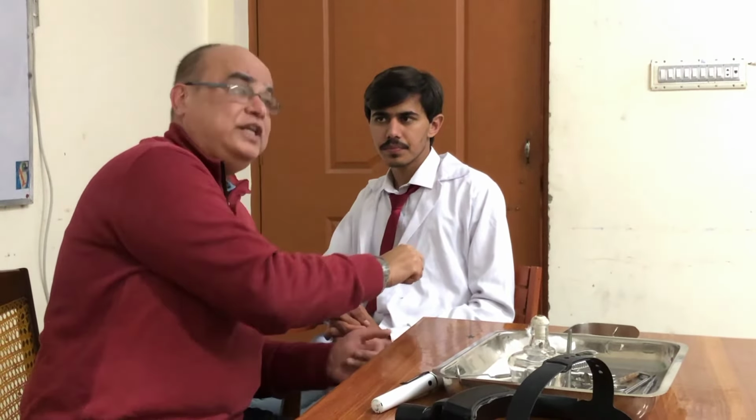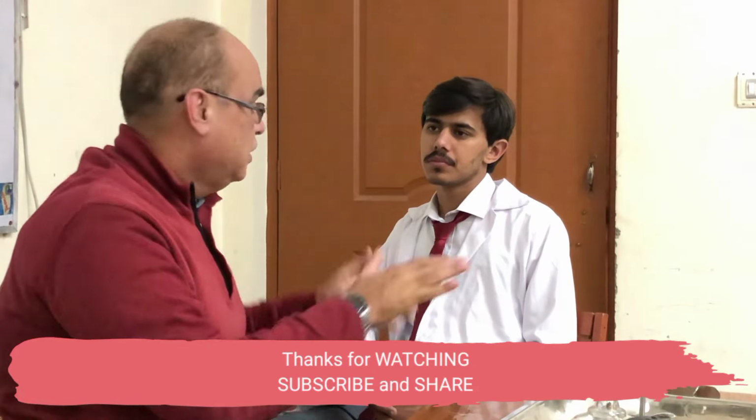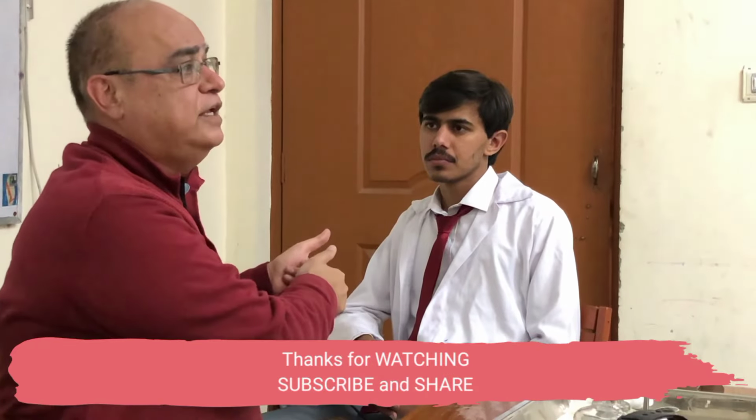then you will go for posterior rhinoscopy, and then we will come to the examination of the physiology of the nose. So we will go for airway patency, which can be checked with a metallic tongue depressor; we cannot use the wooden tongue depressor. Okay, or we can use a wisp of cotton, and then we have to check the smell. After smell we will go for otoscopy, we have to check the sensations of the face, and then we have to check the neck for lymph nodes, and with that we come to the end of our nasal examination. We have to re-drape our patient and say thank you to the patient.